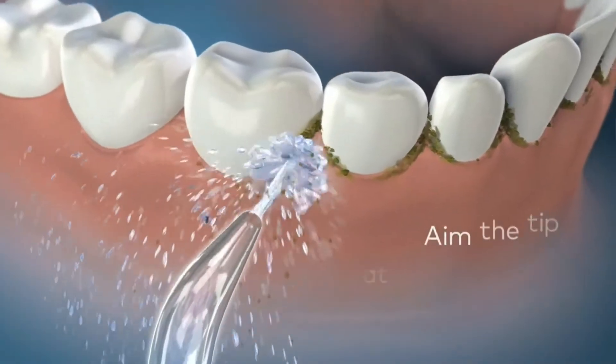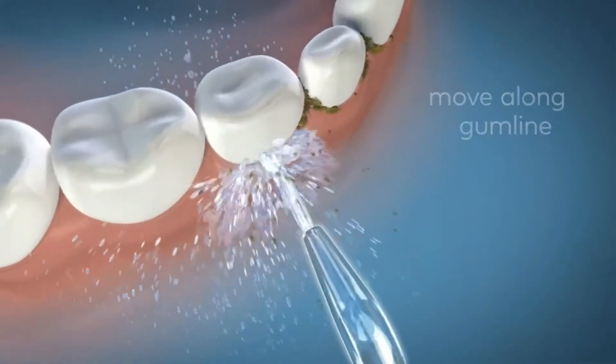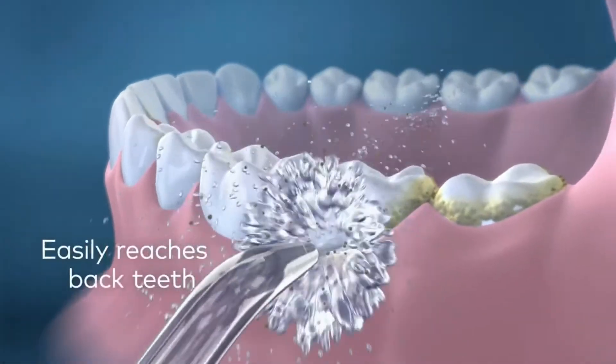The reservoir holds 5 ounces of water, equivalent to 30 seconds of use, and it has a removable tank too, so it's super easy to clean — just throw it in the dishwasher on the top rack.